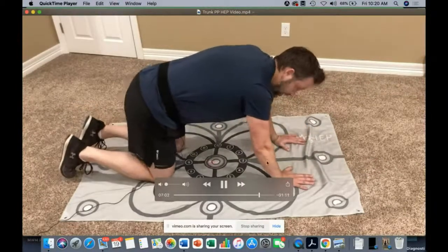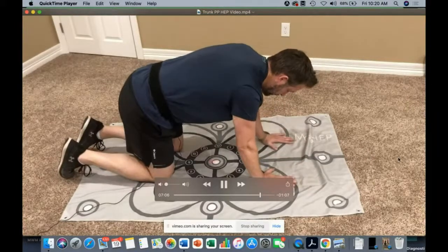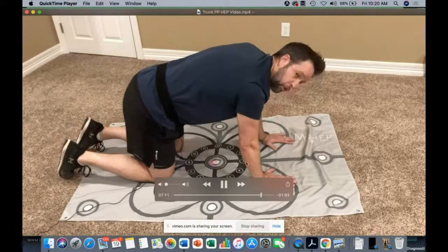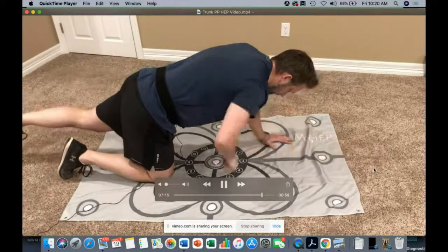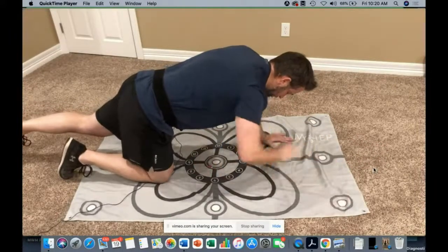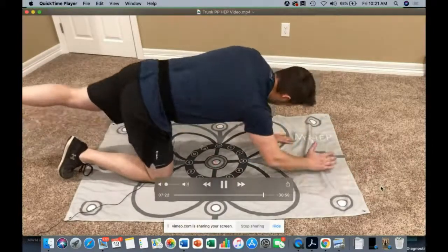Having them crawl while keeping the laser on a line, even if it's a line that you made with tape on the ground or on the carpet in your clinic, and making that engaged, or having them move the laser side to side as they go through that particular activity, really driving some midline cerebellar for posture activities.